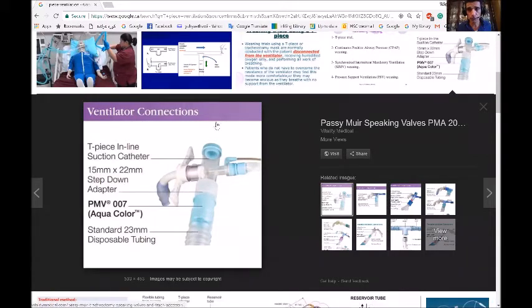When you put your finger on, you give PIP going to the patient. When you take your finger off, you give PEEP. PIP helps to get ventilation, exactly as if you're squeezing and when you're relaxing the bag. But with this one, when you remove your finger, because you are having a valve and the valve controls pressure, you always give PEEP.